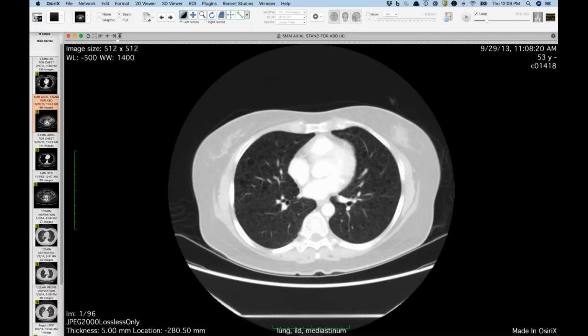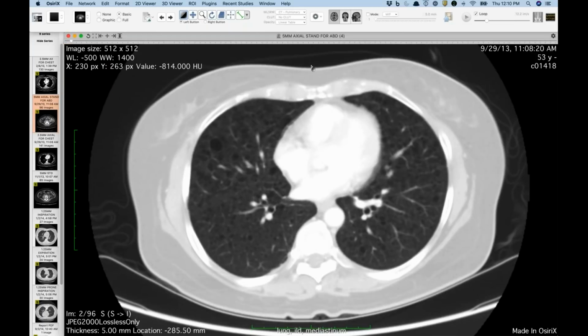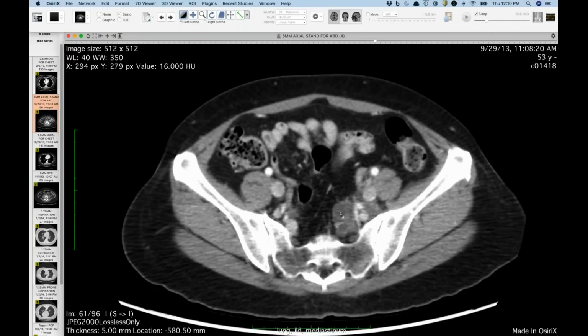So just going through the anterior mediastinal mass differential, certainly thinking thymic neoplasm or maybe lymphoma in an adult would be the most likely things. But this turned out to be just a thymoma. But these are kind of cool.